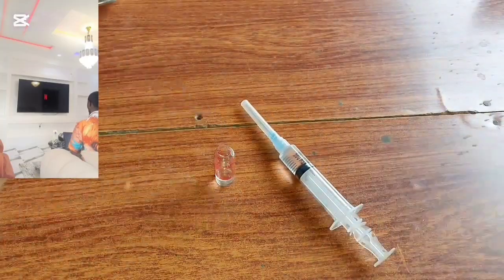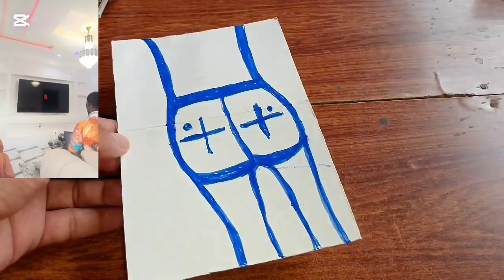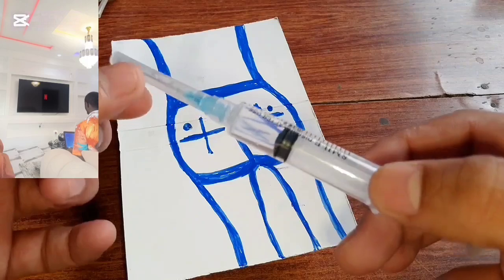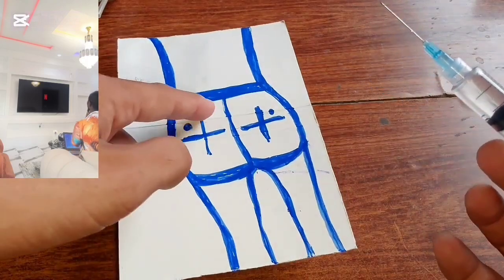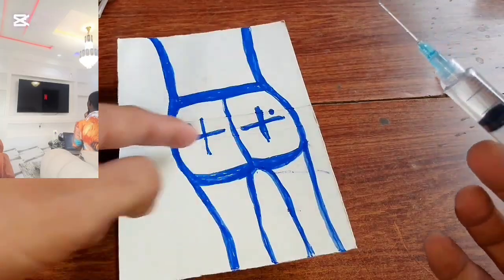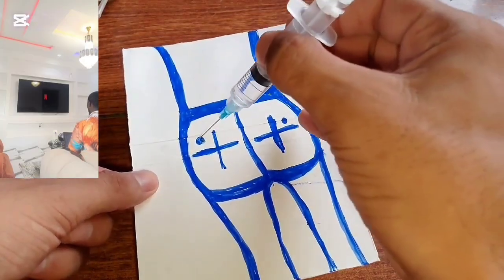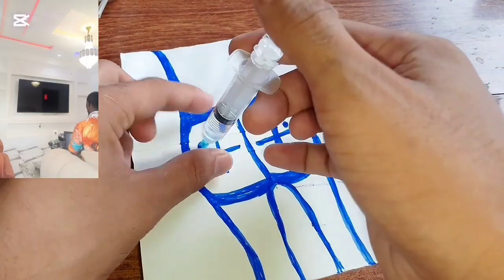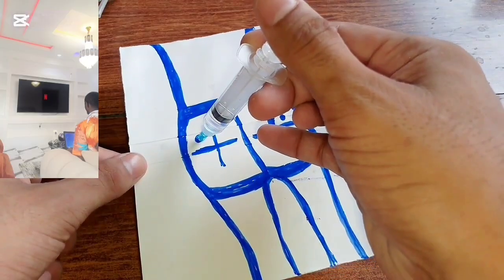This is just a quick tutorial. This is assumed to be a human buttock. Before then, you want to make a cross sign from top to bottom, and make sure you administer at the upper outer quadrant. This is the left buttock.